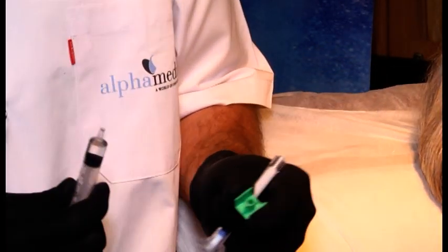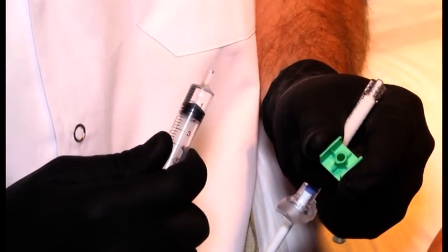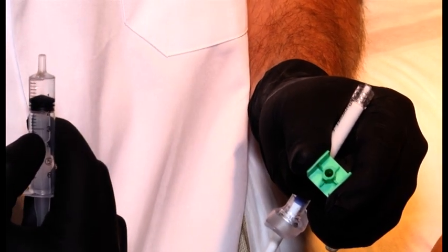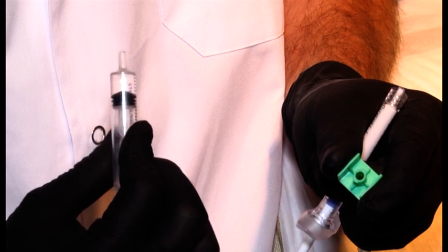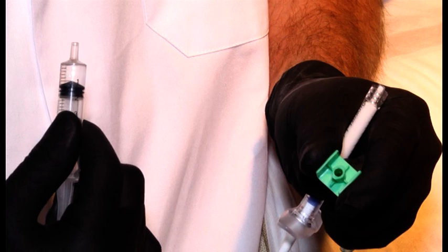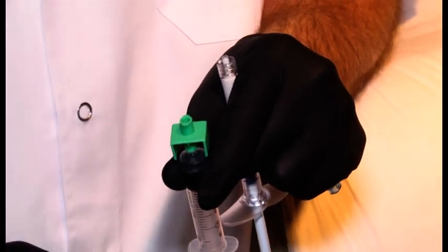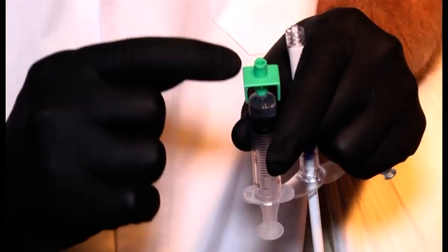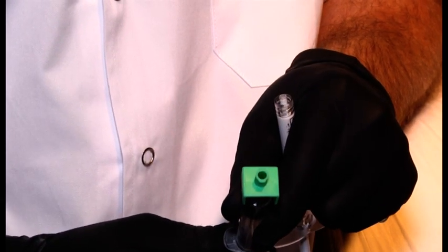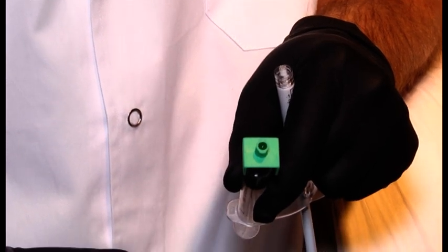Okay, over here, let's see, how can I do this? Over here you can see this is 1.2 cc's, or what is it? Yeah, 1.2 cc's. Where is my marking? Oh, over here. Right, 1.2. So I attach the luer lock connector. Now this is usually where it goes wrong, because in this whole system there is some air. So I have to take out the air by pressing. You see now there's no more air in the system.